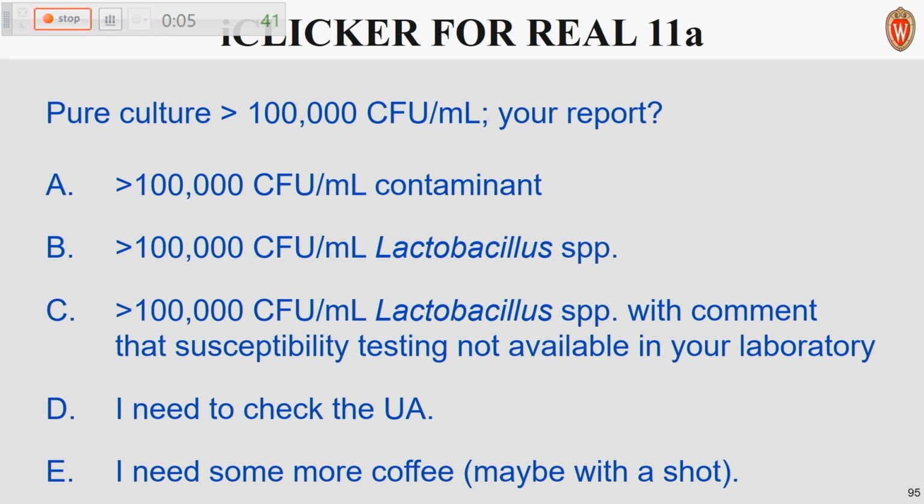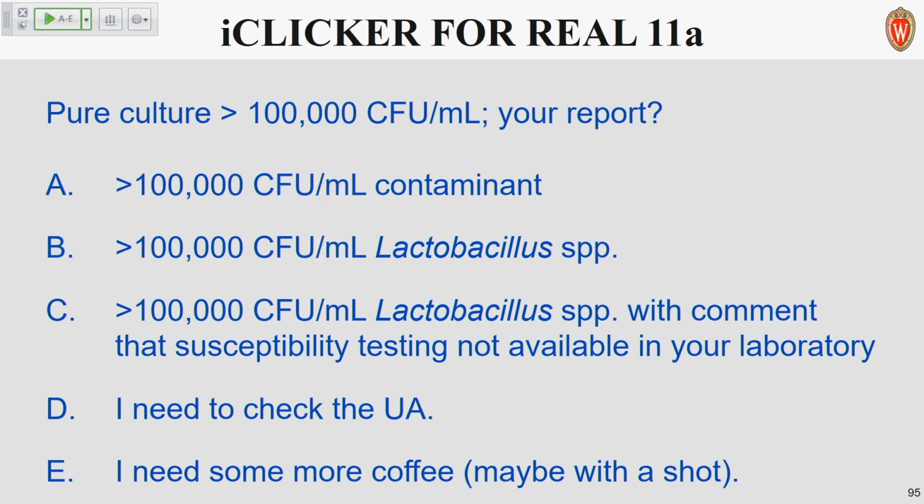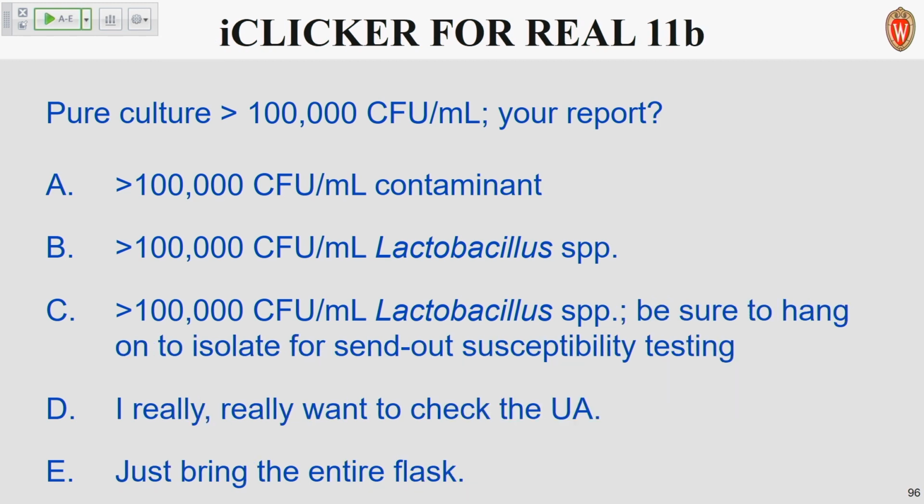All right, what are we doing with our lactobacillus in pure culture? Was that a contaminant? Is that A? A is a contaminant. Okay. And then we've got reporting species, and then we've got species with a comment. So it looks like it's pretty evenly distributed. Correct. Okay. It's the same thing, I think.